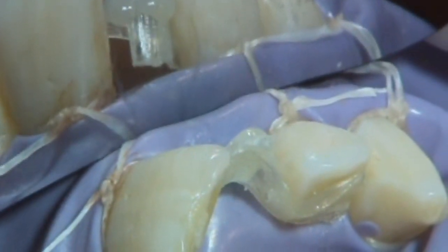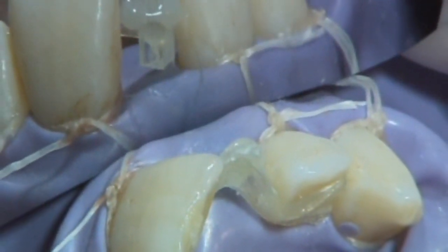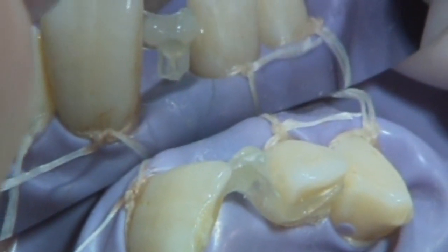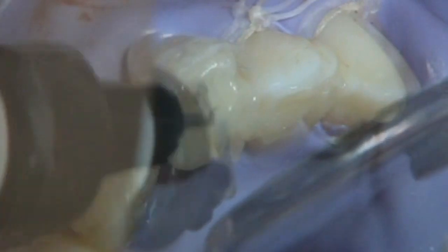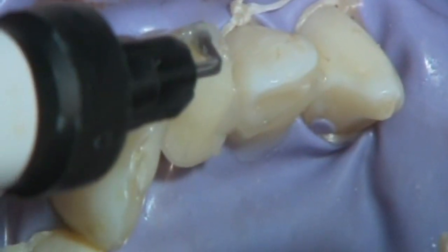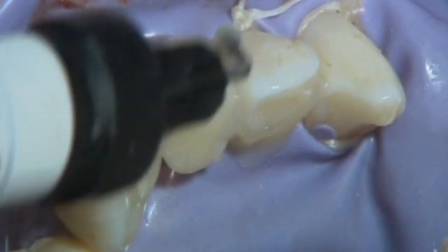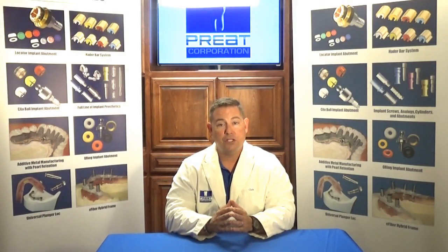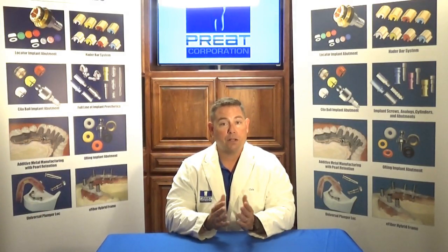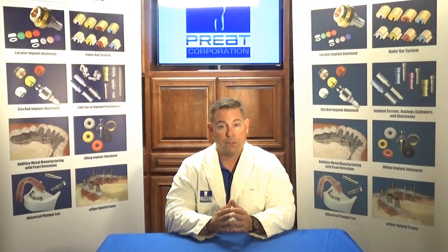Making sure that the fiber wings are out of the opposing bite, we take a second piece of fiber and place it perpendicular to the first piece, creating almost a T fiber reinforced framework. We place our pontic former down on the gingiva and then using our composite, build up our pontic. This is a simple, easy way of providing an immediate temporary restoration.